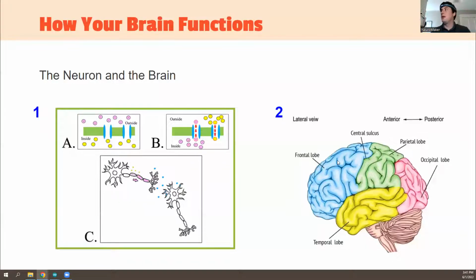As an example of other places, we're not going to talk through everything, but another example is your occipital lobe here. If you measure different activity coming from the back of your head, right here on the occipital lobe, that's connected to a lot of your eye activity. So if you were to close your eyes, or if you were to focus on something with your eyesight, you'd notice a lot of activity here. But as we mentioned, this frontal lobe here is where this sensor is, right?